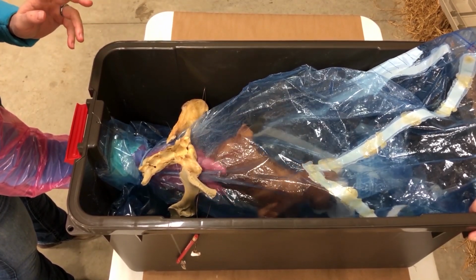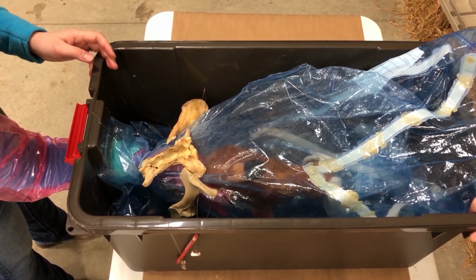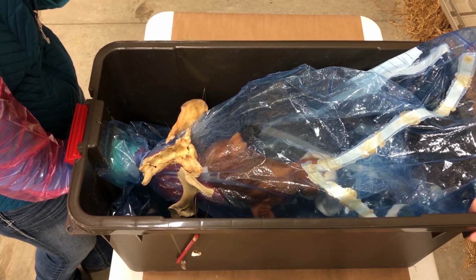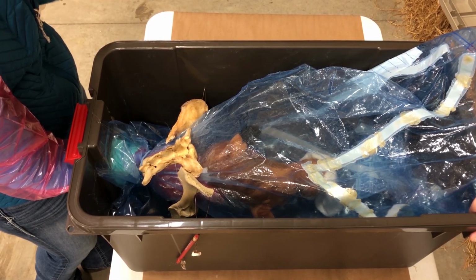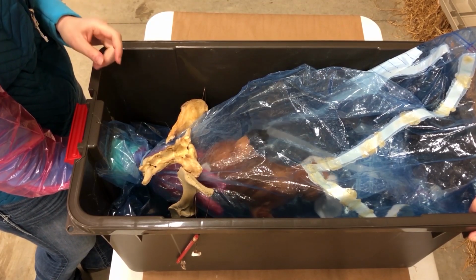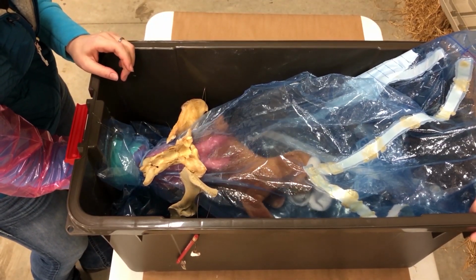So when I've made the decision that I'm pulling this lamb or kid backwards, we want to be sure that we're going fast. Once that umbilical cord snaps, that animal is going to be taking a breath of air, and that head is still going to be inside the amniotic fluid. So we want to be sure we're going as fast as possible.